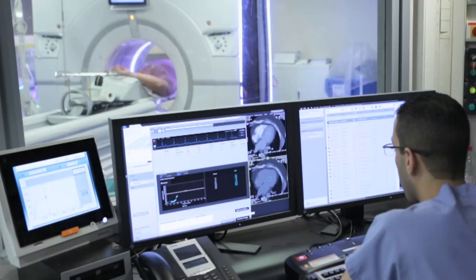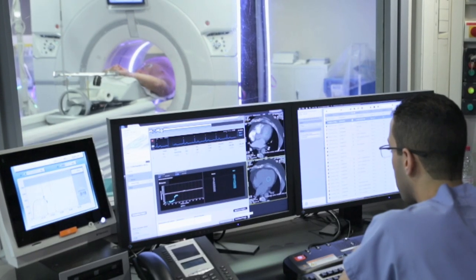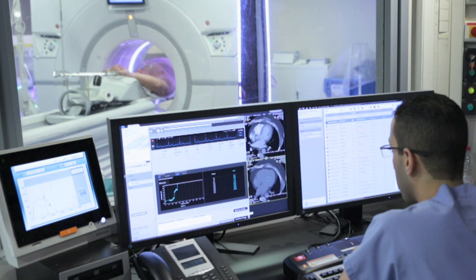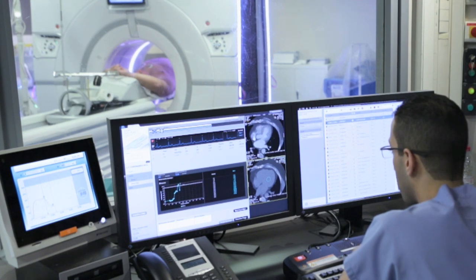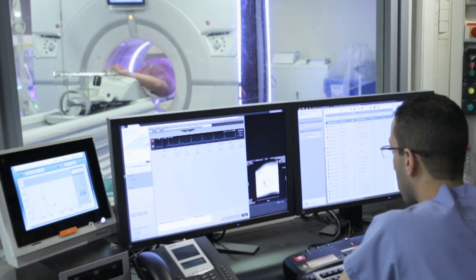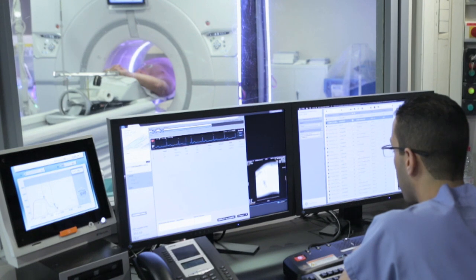The automatic bolus tracking system helps you synchronize the acquisition with the injection. Once the predefined threshold is reached, the acquisition is triggered and the entire examination is performed in only one beat.